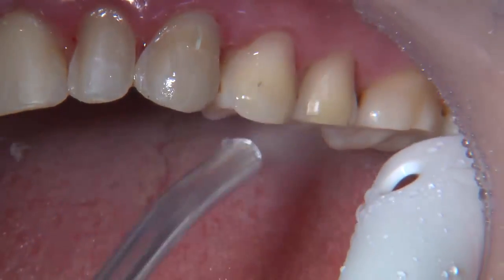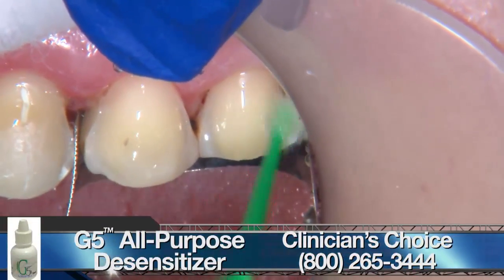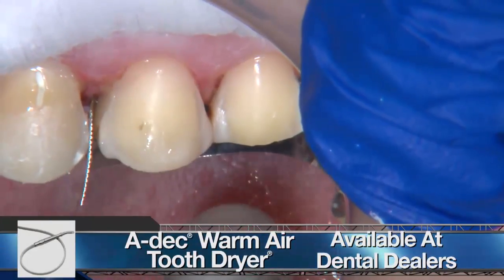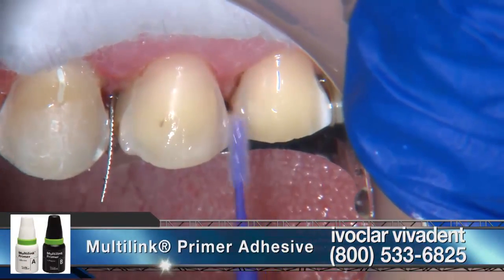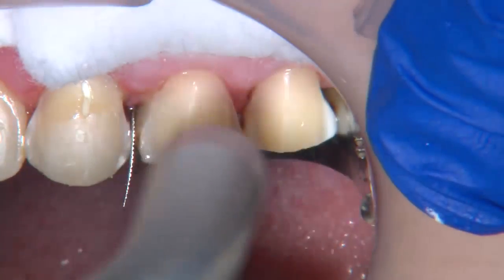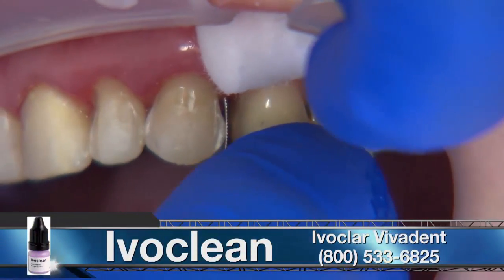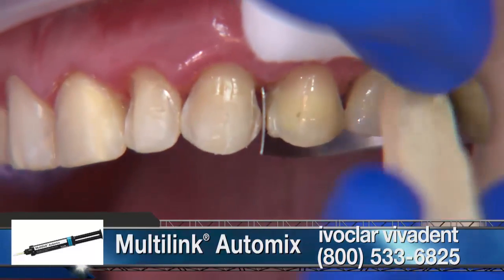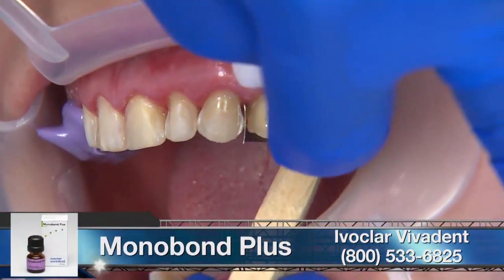After cleaning the prepared teeth with Prepase pumice from Whip Mix, G5 was applied as an antibacterial and desensitizer agent. Because the preparation was on enamel, an air-dry technique was used to prevent any contamination. A and B primers were applied to get the tooth ready for the resin cement. Prior to cementation, the intaglio surface of each veneer was treated with Ivoclean for 20 seconds. Before loading the veneers with Multilink, Monobond Plus was also applied for 60 seconds.